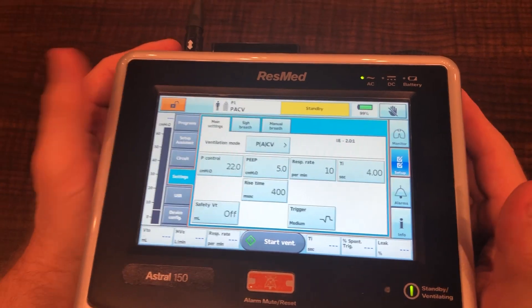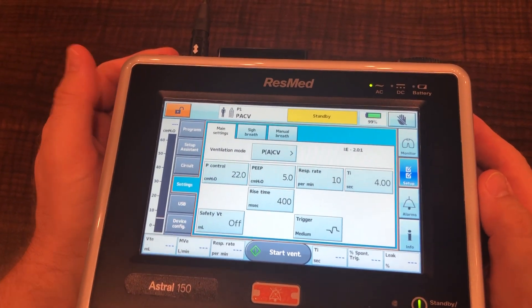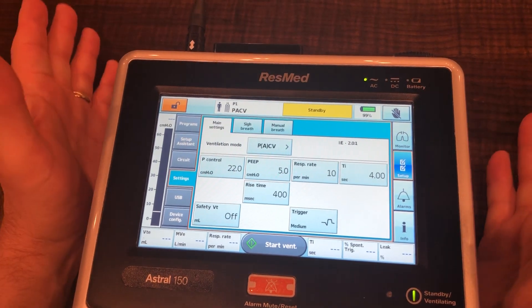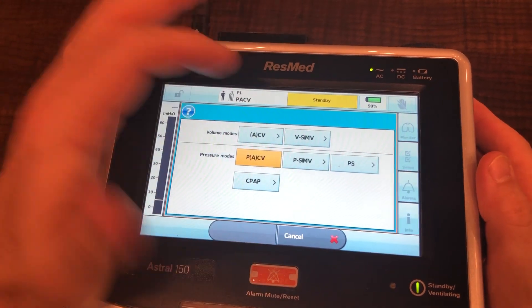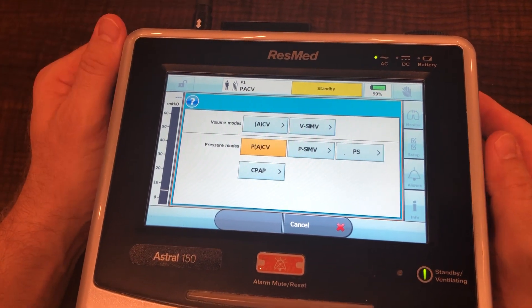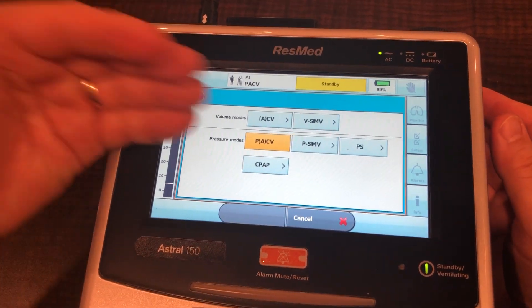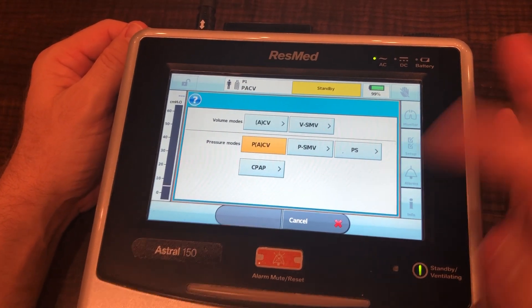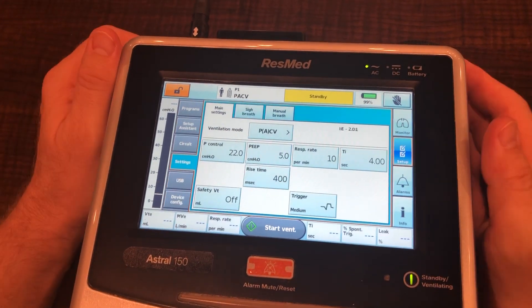As you can see there's a lot going on here, but we can break it down quickly. Our ventilation mode is right here — we are in pressure assist control. By pushing that button we can take a look at all the other modes. We've got our volume modes at the top and then our pressure modes on the bottom. For the demonstration we're going to go pressure control assist control, so I'm just going to go back.